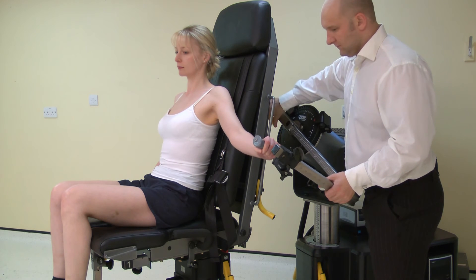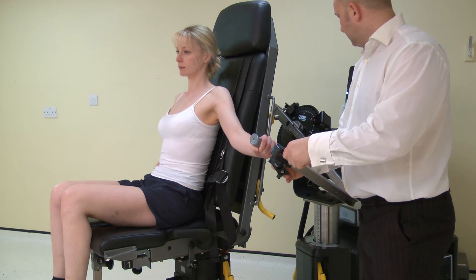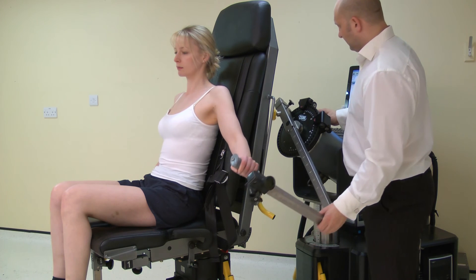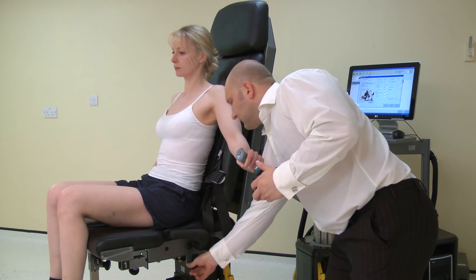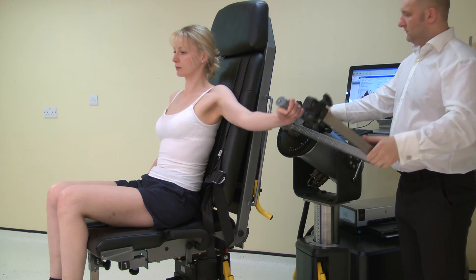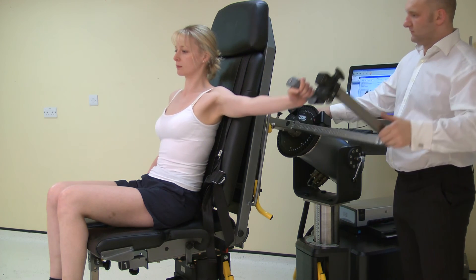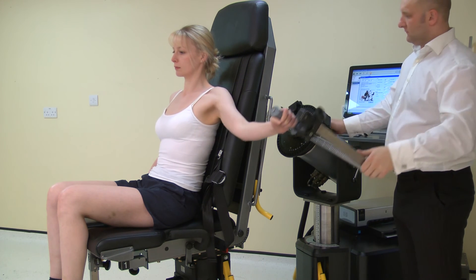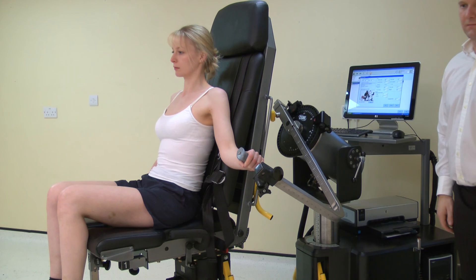Top tip: try to leave the elbow a few degrees from full extension. Adjust the hand grip position until the arm is parallel with the trunk; if further adjustment is required, alter the monorail. Check the axis of rotation. Note: the axis for this position may move superiorly during the motion. Because of this, the elbow may flex and extend to some degree during the test — this is normal. If less elbow motion is required, split the test into a first segment of 90 degrees, then a second segment from 90 degrees into full abduction.